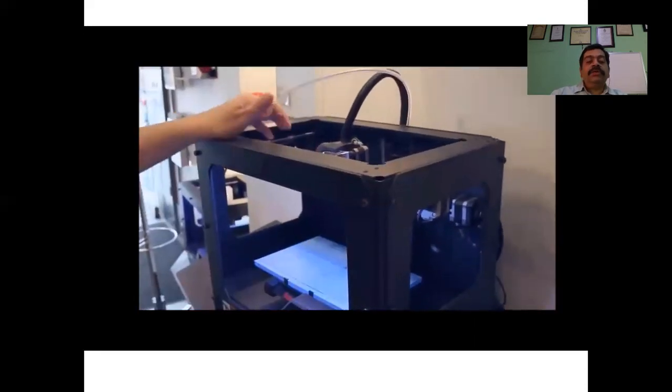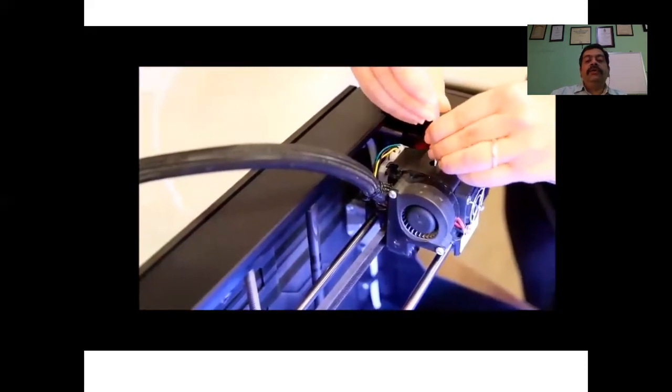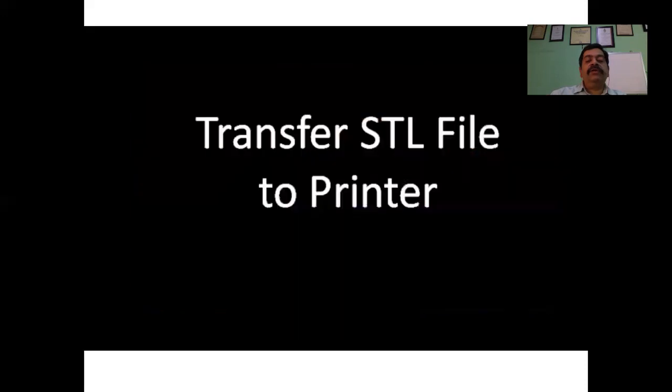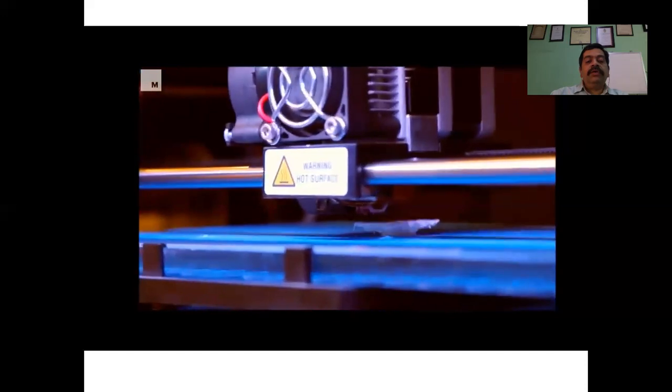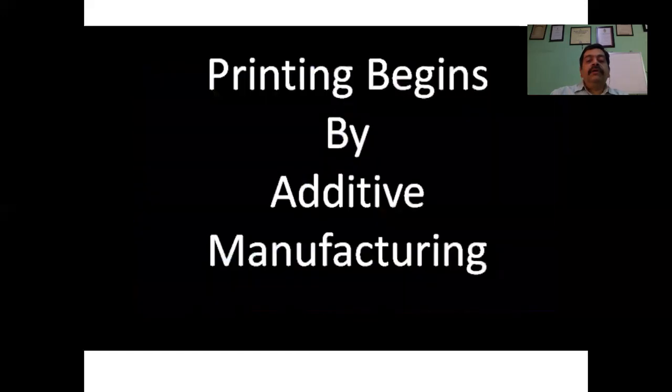And the printers which are handy, the FDM printers, are like a microwave in which the material is loaded into an extruder, which is at high temperature, and it melts the plastic. You transfer your design, the STL file, to a printer by directly connecting it with your computer or through a memory stick. Once you've done that, and you enter, the printing starts. Now, printing begins with additive manufacturing. That means it goes layer by layer.